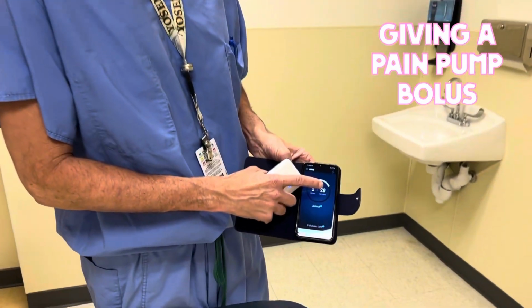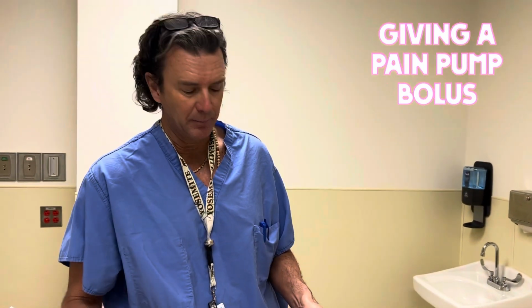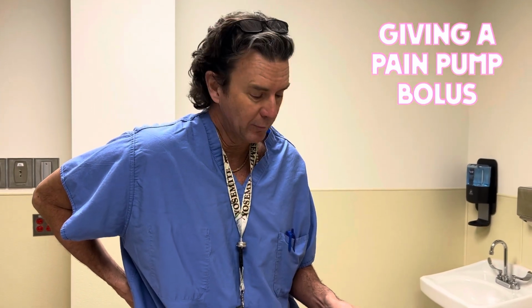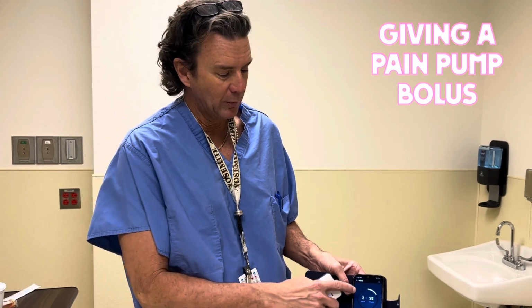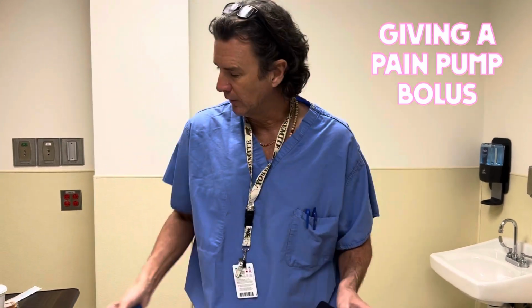All you would do is hit the play button, and right now it's telling us the bolus is unavailable because she's already had a bolus. But if we hit that play button and held this directly over the pump, it would say bolus given, and then this clock would reset to 2 hours 59 minutes. And so once it goes down, you can give it again.